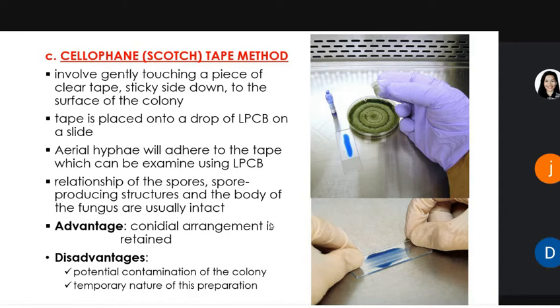Doon sa nabasa mo. Ma'am, yun yung parang sa anus, ma'am, di ba? Mm-mm. Opo. Bali yung scotch tape po, ibubukas po yung pisngi ng puwet. Opo. Okay. Tapos saka na po, anong kinokollect mo? Yung Enterobius vermicularis po. Anong form ni Enterobius vermicularis? Anong didikit dun sa tape?